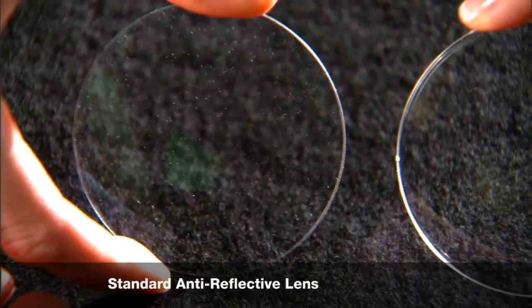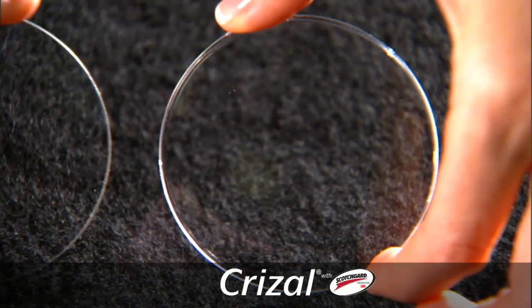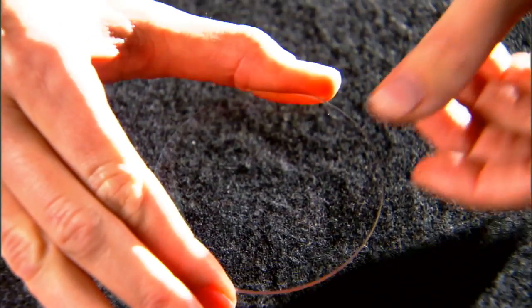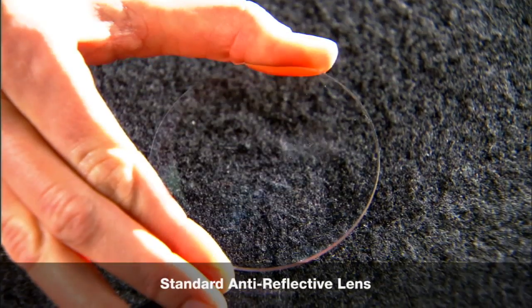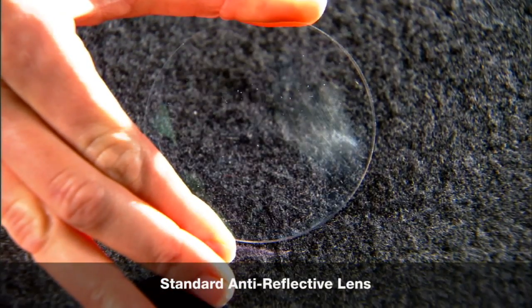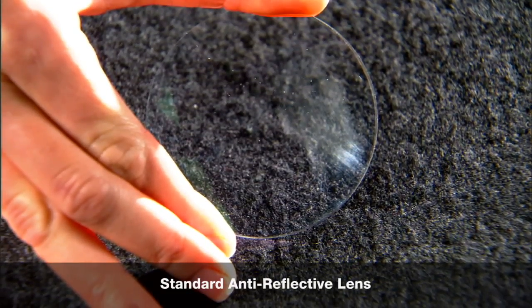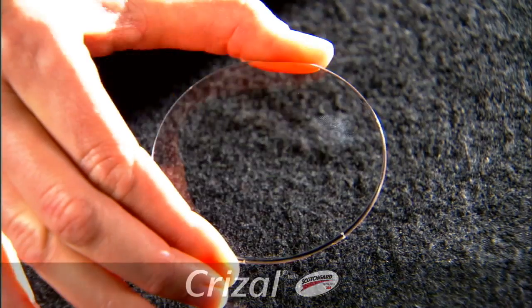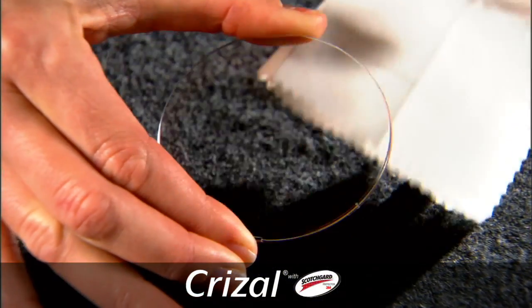Look at the difference between the two lenses immediately after cleaning with a paper towel. Chrysal lenses with Scotchgard Protector reduce the appearance of fingerprints. Notice with the standard no-glare lens how the smudge from the fingerprint remains. But on the Chrysal lens, the fingerprint is easily wiped away.